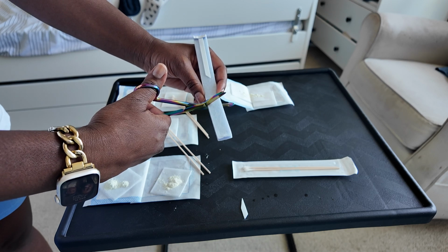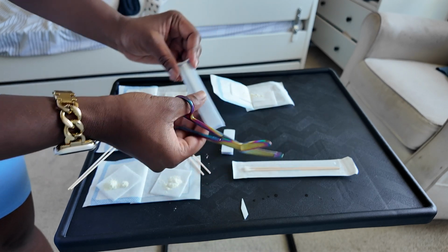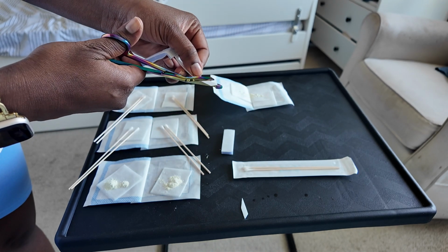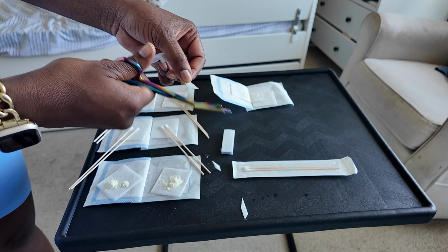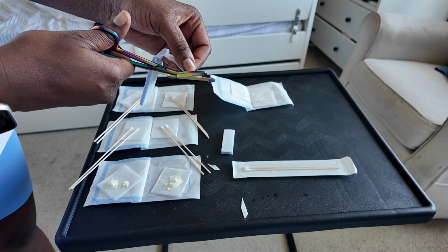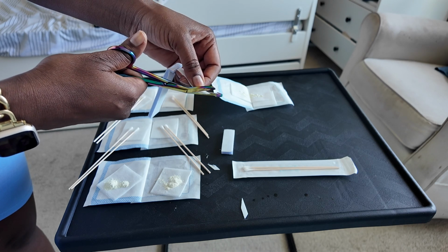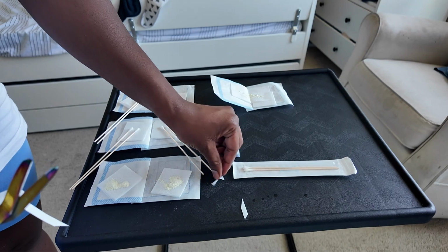And because this pediatric trach tie is set for a longer neck, I can look at it and eye it and know the size she needs. But what we also do is use a sample for our nurses and for others who might be doing trach care. It's really key so you have the right size. You want to make sure you know the right measurement, because you don't want to have to cut or put it on and it's too small. It can't fit around the neck.